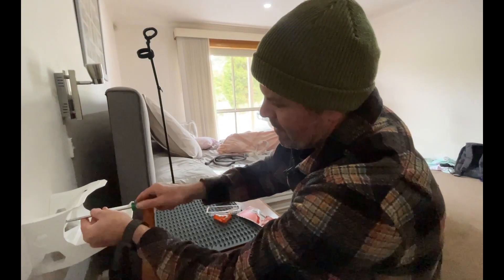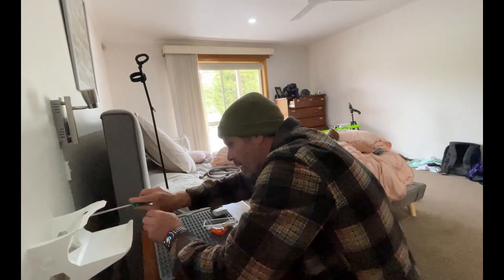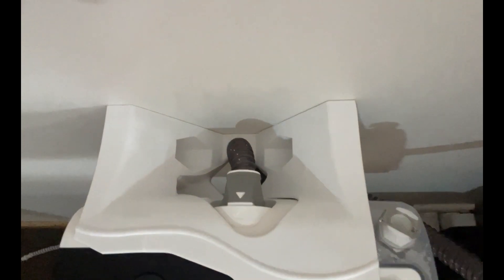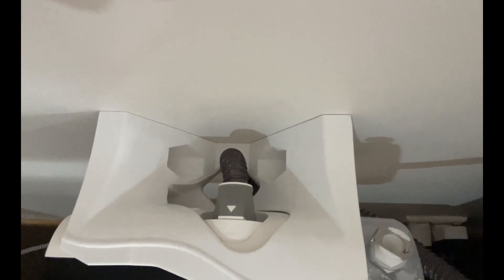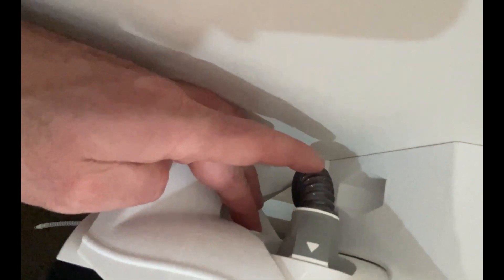Here's where the screws go. Let's just go hand tight. Goes in the hole there. And that's how it looks from the top. And then the power through the bottom here — it just goes in there.